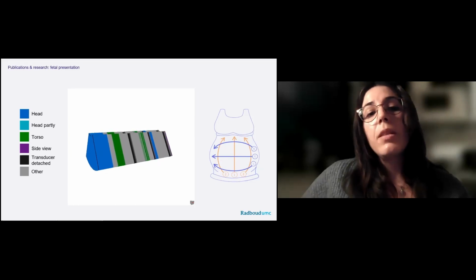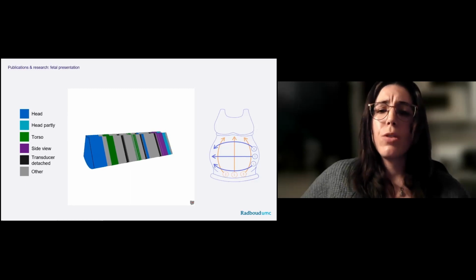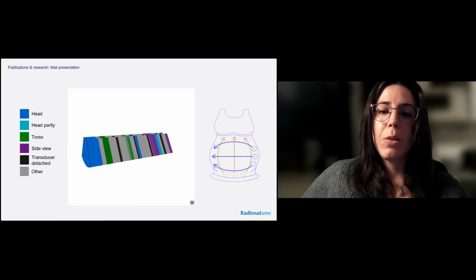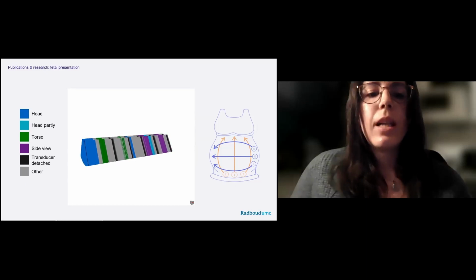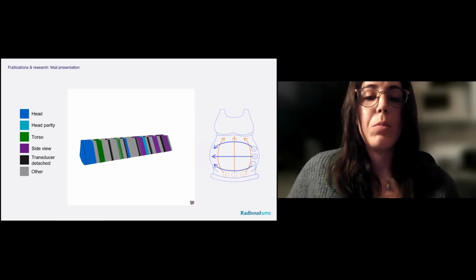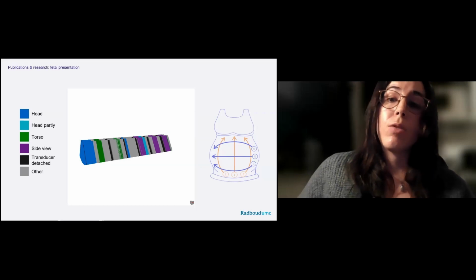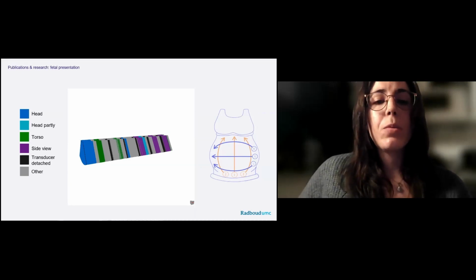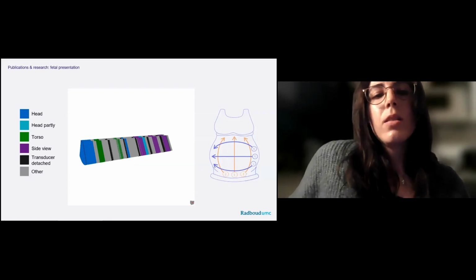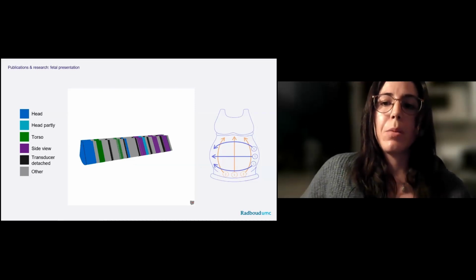This means that we have ended sweep 1 acquisition, which, if you see the image on the right, goes from the bottom, the patient's midline, from bottom to top. And every time we see these dark images in this volume that I'm drawing here, it means that we are moving on to another sweep because we lift the probe. Right now, this might not seem really straightforward to you. It's not really readable for us.